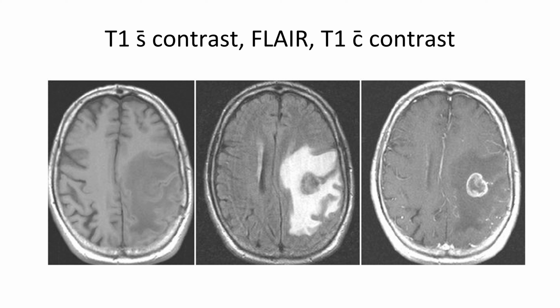Now again, as I mentioned before, with an enhancing lesion, the differential diagnosis on this is extensive. It could be many, many different things, anything from tumor or metastatic tumor to an infectious process, an abscess, to an infarct or some lymphoproliferative disorder, some demyelinating disease. It could be a lot of things, but typically there are various clues that'll help you pinpoint what it is just from the imaging alone.